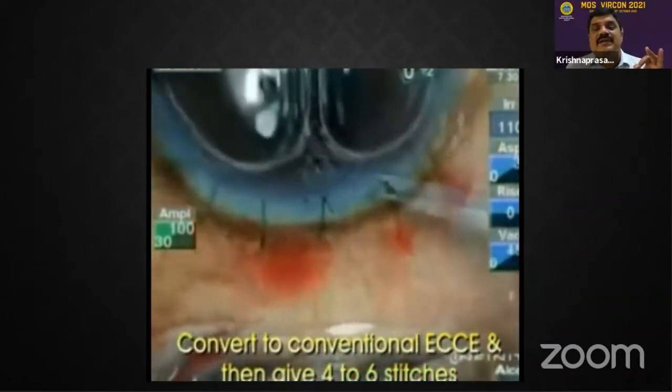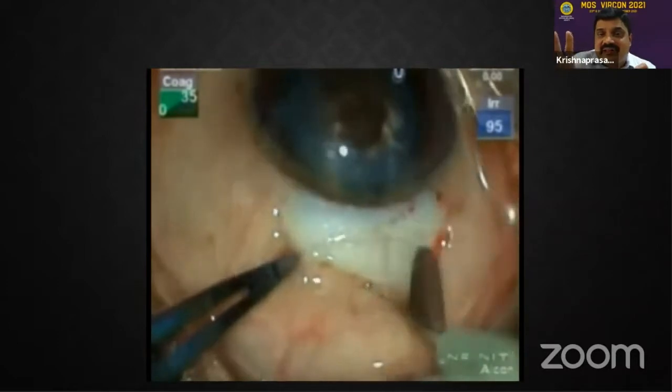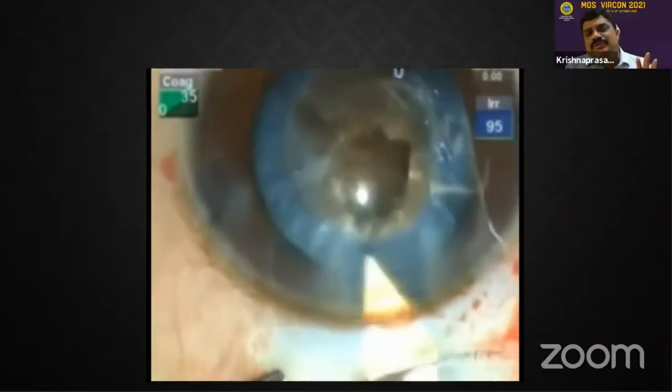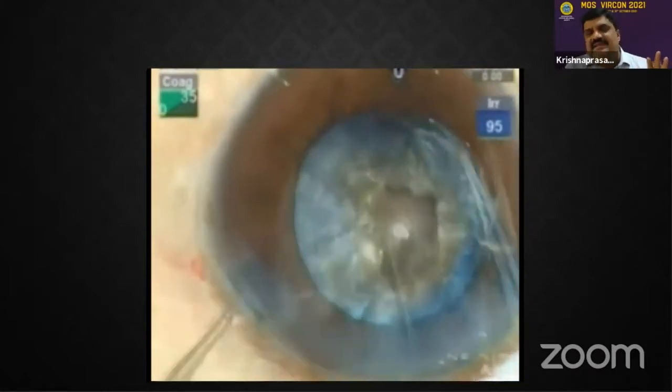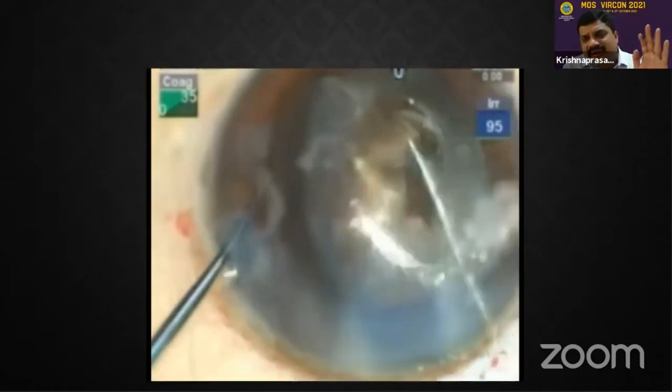This is one more case with a brown nucleus. When you're trying, you could see a sudden deepening of the anterior chamber. That means there is already a rent. Convert into SICS. Then make almost a 6.5 to 7 mm tunnel. Then increase the rhexis, then get the nucleus into the anterior chamber, a sort of railroad technique with minimal manipulation so that it will not damage any zonules.